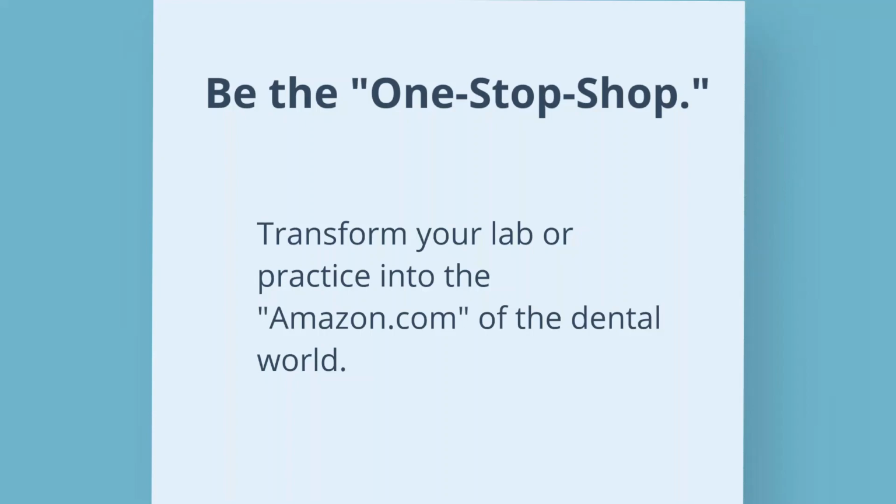I think as a laboratory, by being able to offer your doctors such a wide range of products, you're increasing the appeal of that doctor wanting to send you work. Same thing if you're a doctor. If your office is able to offer a wide range of services to your patients, it's going to entice patients to come to you.